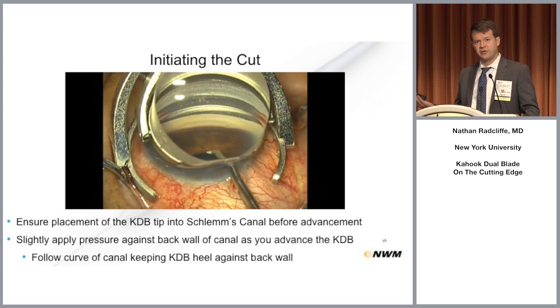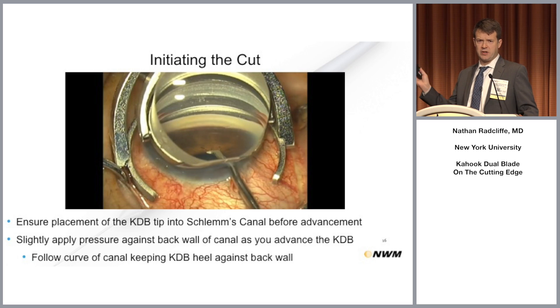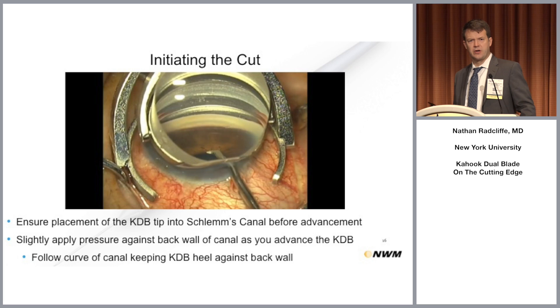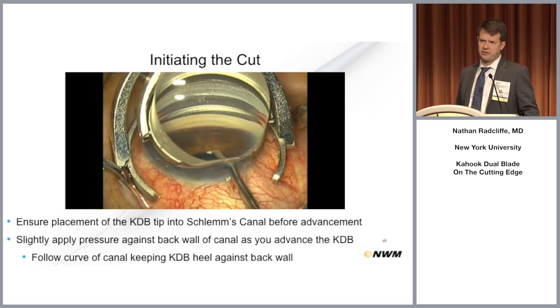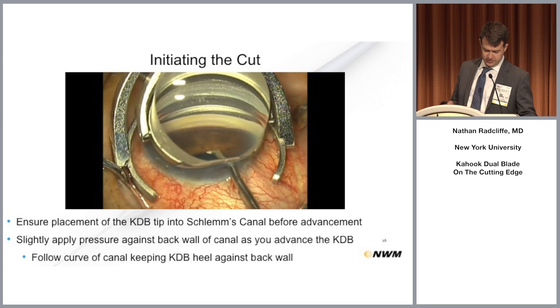This is similar to initiating a trabectome surgery, iStent placement, viscocanalostomy, or trab 360. Apply a little pressure and gently pierce the trabecular meshwork to get inside the canal of Schlemm. Once you do this, with only a little pressure, move the Kahook Dual Blade along the canal and excise the trabecular meshwork. If the eye is moving when you move the instrument, you're probably a little too deep and engaging the posterior wall of Schlemm's canal, which you don't want to do.